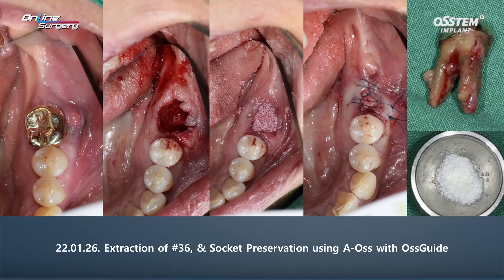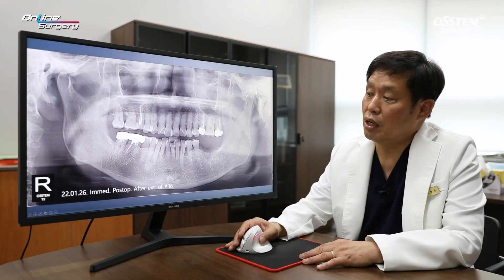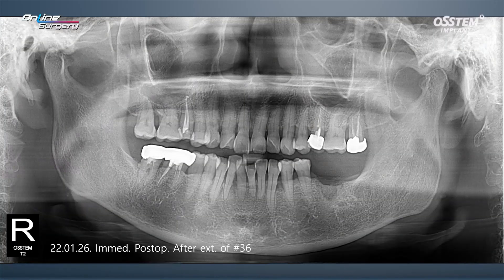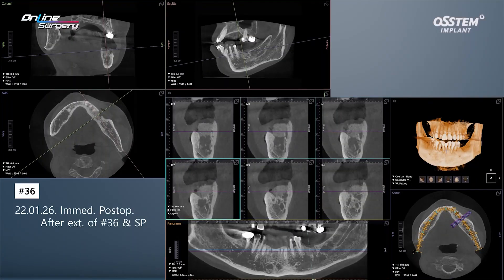This is the panoramic x-ray right after surgery. In the area where the defect used to be, AOS has been grafted. CT was not taken before extraction, but after extraction, you can see AOS was used for bone graft.